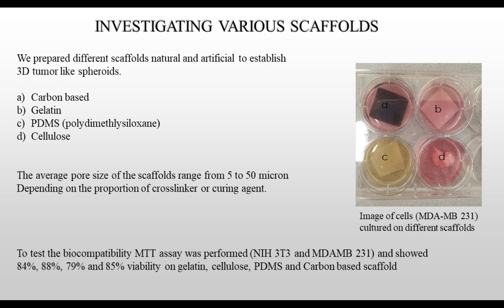Our first step of study was to investigate different scaffolds which would serve as a 3D architecture for the cells to grow. We selected gelatin, cellulose, PDMS, and one novel scaffold, which is a carbon-based scaffold, for our study. The study is still under investigation, but I would like to share some very preliminary results. The average pore size of the scaffolds ranges from 5 to 50 micron, which depends on the synthesis protocol and how we make the different scaffolds.